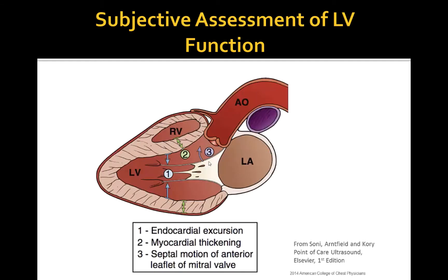The examination of LV focuses on evaluating motion of the left ventricular walls by a visual estimation of the volume change from diastole to systole. Three main components of LV function assessment include the following. First, estimating the endocardial excursion — in other words, movement of each portion of the endocardium towards the center of the heart.